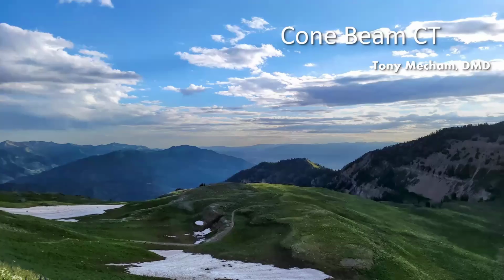Those of you that have, what's the point of cone beam CT? Why do so many dentists use it now? And more are using it every day. Yeah, that's the big driver, probably the number one driver, implant planning, right? It's always good to be able to see a 3D view of the bone when you can.